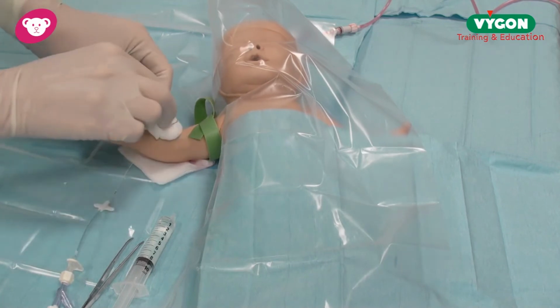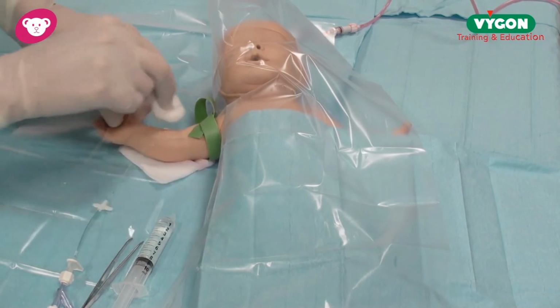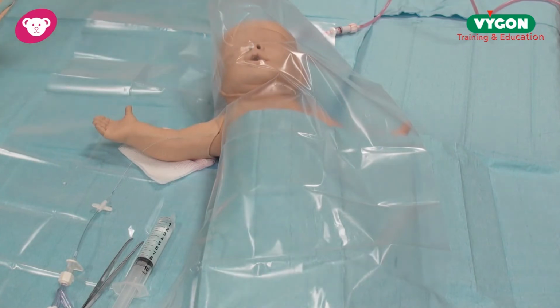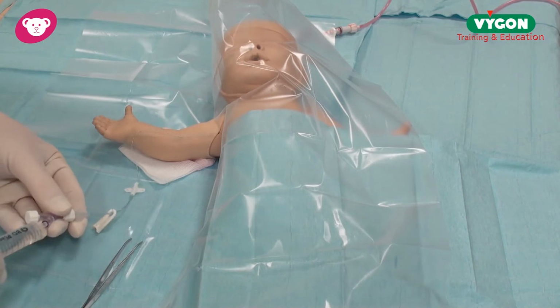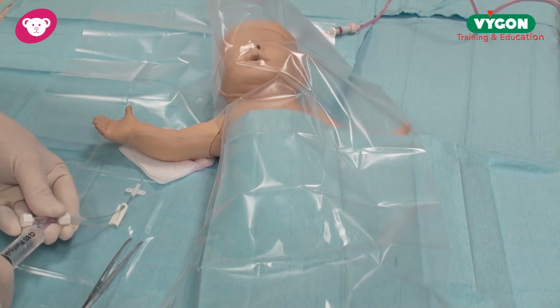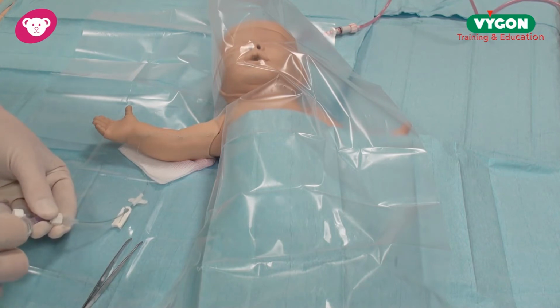At this point, just to make sure that all the blood is absorbed with my swabs, I'm just going to remove my tourniquet, and it is advisable, if possible, to just get a little blood return. This is not always possible with a catheter with a stylet, and then push pause to make sure no blood is left in the catheter.